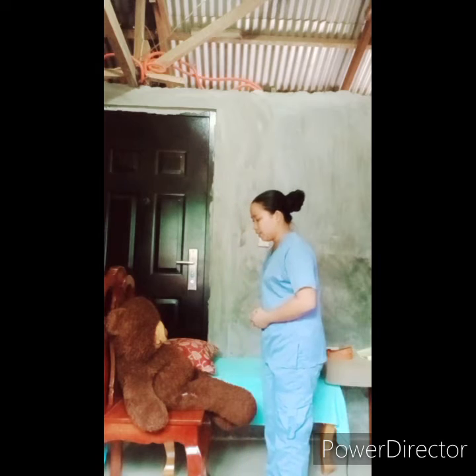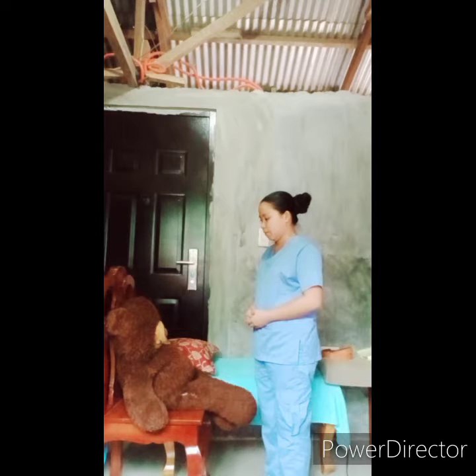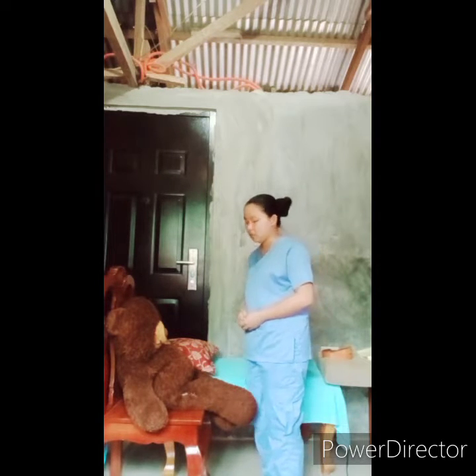Good morning, ma'am. I am Giselle B. Esteban, your student nurse for today. May I know your name, ma'am? Can you state your name and your birthday? Okay, Miss Papin, I am your nurse for today. Ma'am, I'm going to perform wheelchair transfer technique. You can participate, ma'am, by simply following all the instructions given to you. Okay, ma'am? Thank you, ma'am.